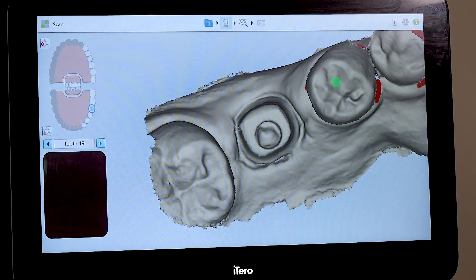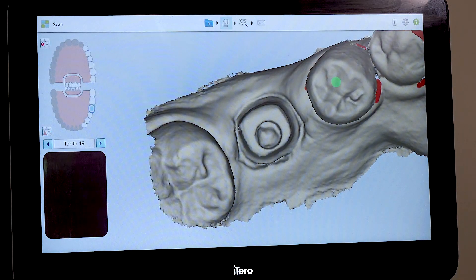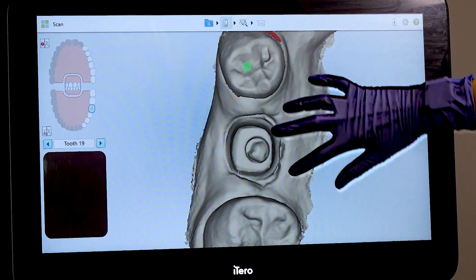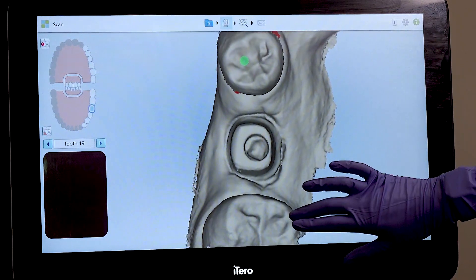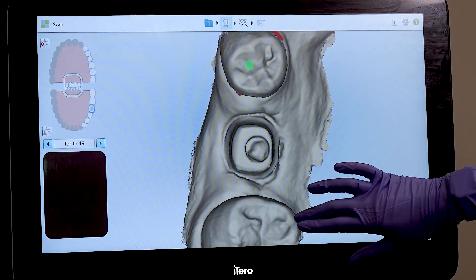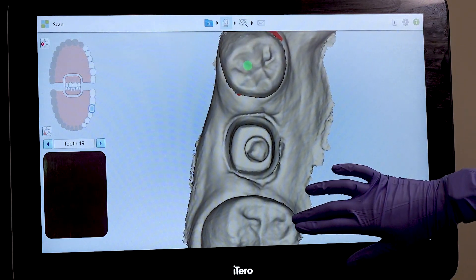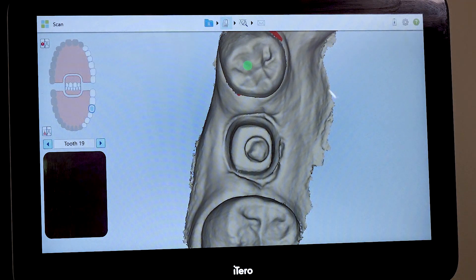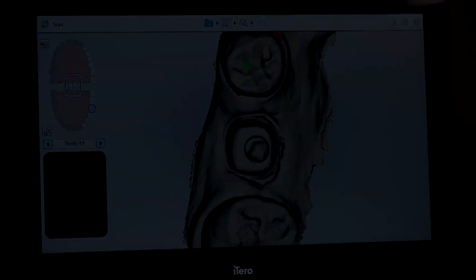Be sure to check the post-processing scan to ensure the margin, the body of the abutment, and the adjacent contacts are clear and clean, ensuring that the laboratory will have all the information they need to fabricate a well-fitting and functional restoration.